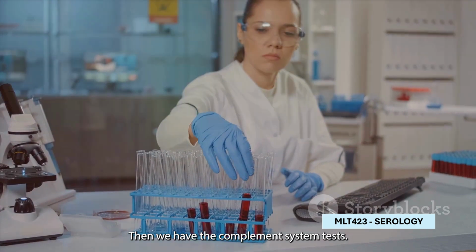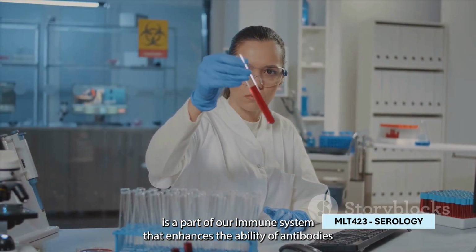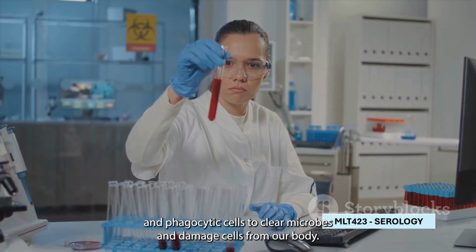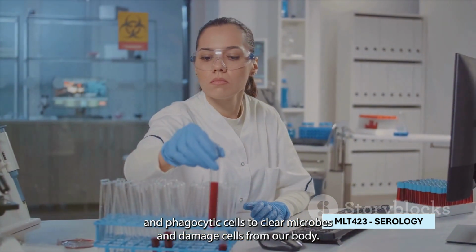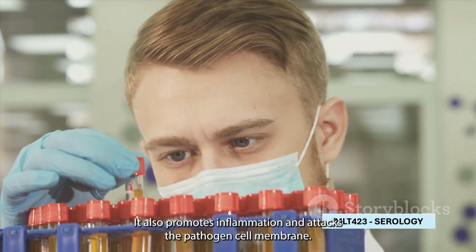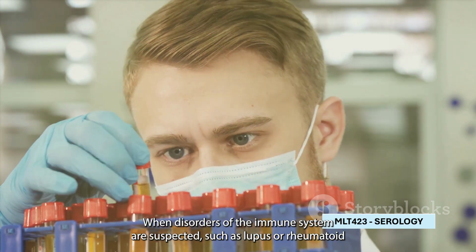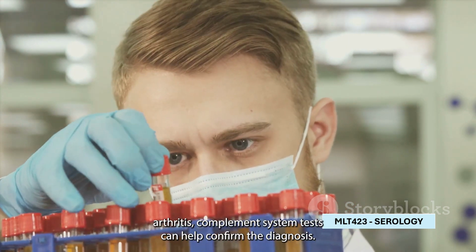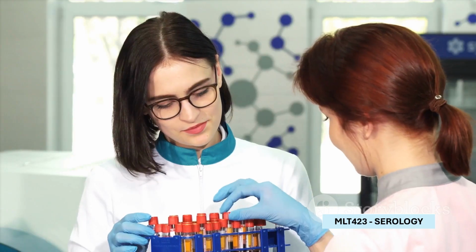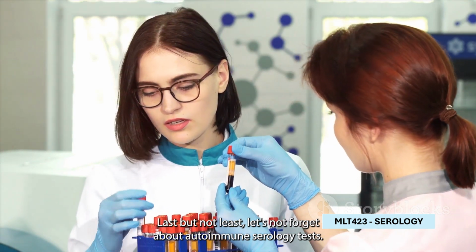Then we have the complement system tests. The complement system is a part of our immune system that enhances the ability of antibodies and phagocytic cells to clear microbes and damaged cells from our body. It also promotes inflammation and attacks the pathogen's cell membrane. When disorders of the immune system are suspected, such as lupus or rheumatoid arthritis, complement system tests can help confirm the diagnosis. Last but not least, let's not forget about autoimmune serology tests.